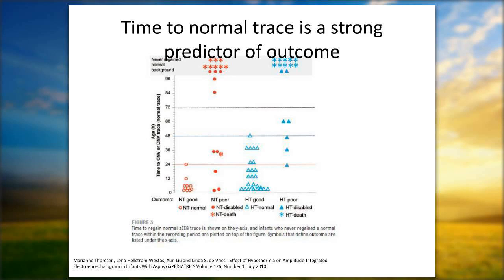We find a lot of resistance here for needles in our small preemies. Most people will use the hydrogels for that size baby. I know there's a cardiologist very interested in aEEG at Loma Linda here in California, and she's doing a study of babies with congenital heart disease as well. So she might be someone to pair you up with at some point.